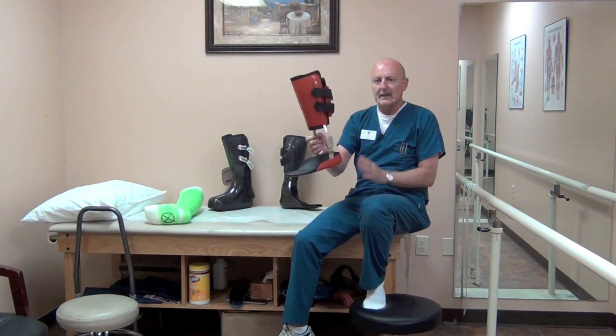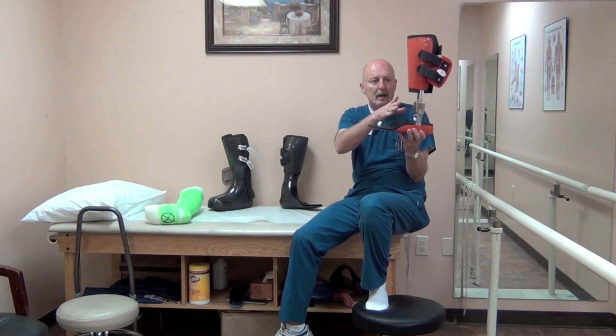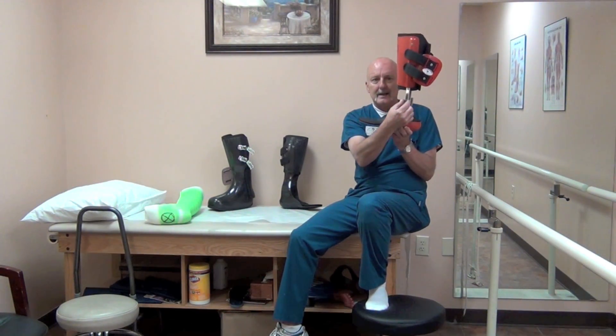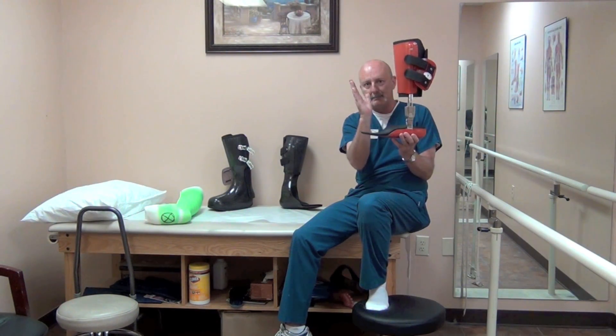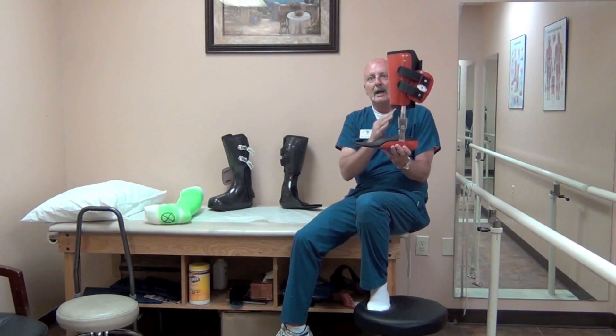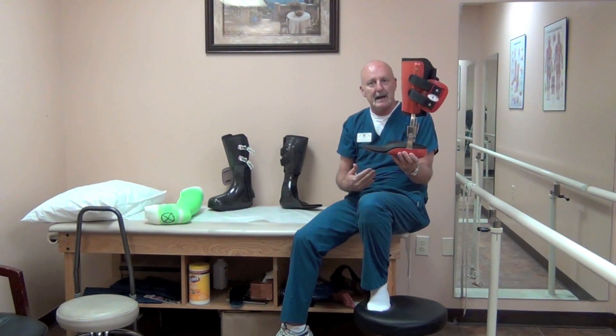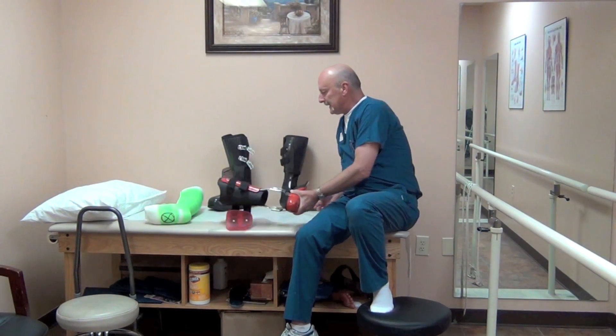This is the design that is going to be most effective. It's a double upright design with dual channels so that we can adjust the angles in dorsiflexion or plantarflexion to fine tune gait. By being able to adjust this, we can establish a better gait pattern individually for the patient.